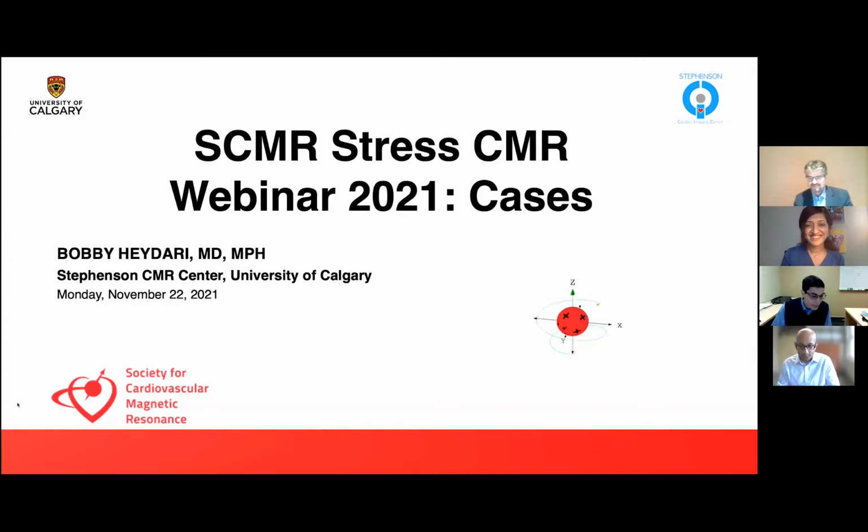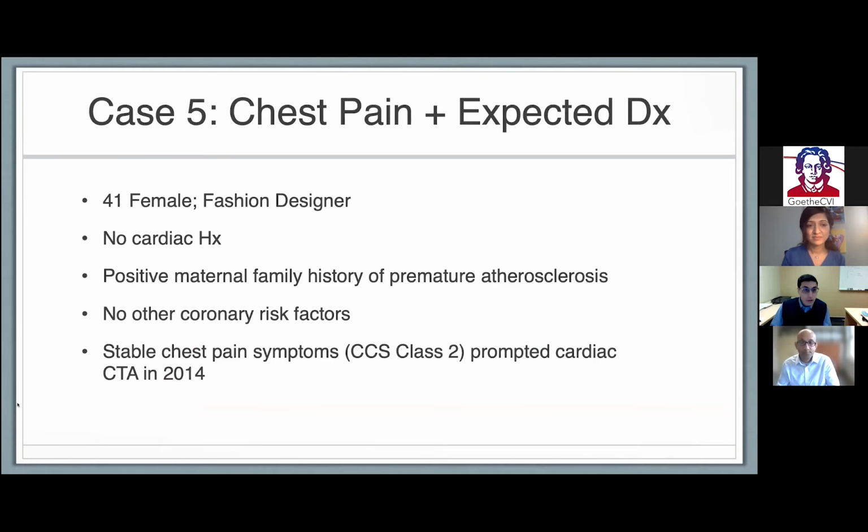Thank you so much for that introduction, Dr. Nagel, and to SCMR for inviting me, and of course to our illustrious moderators. So I'm going to present two cases. The first case is a patient with chest pain and an expected diagnosis.